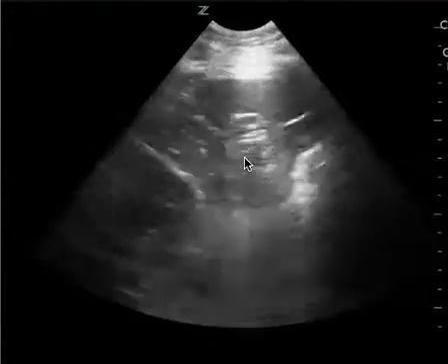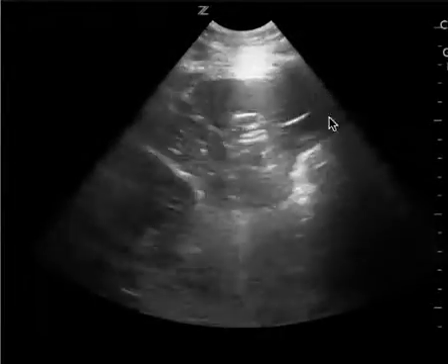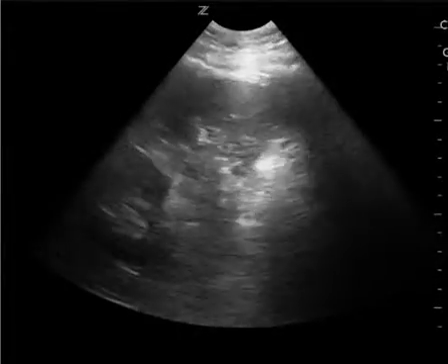This is also technically limited only because I'm unable to see the spleno-diaphragmatic space, which should be someplace over here, and that's the most sensitive area where you want to look for free fluid in the left upper quadrant.